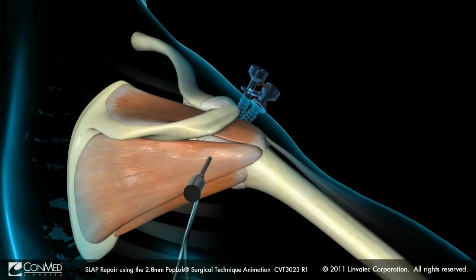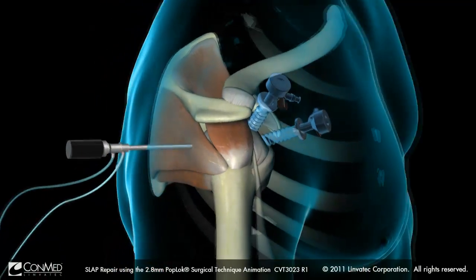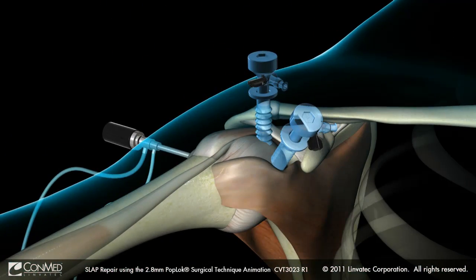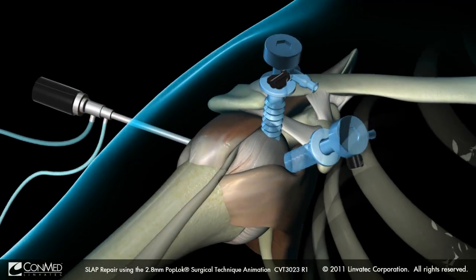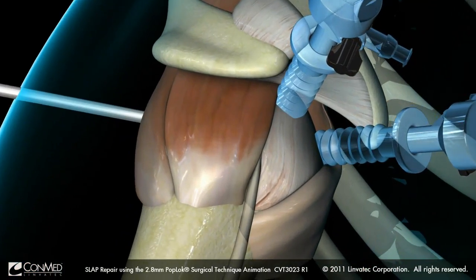The following SLAP reconstruction will be viewed from the posterior mid-glenoid portal. An accessory anterior portal is made just superior to the subscapularis. The working portal is made either through the leading edge of the supraspinatus or through the rotator interval.